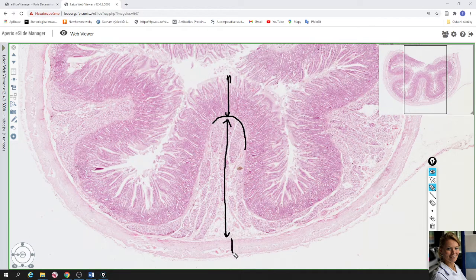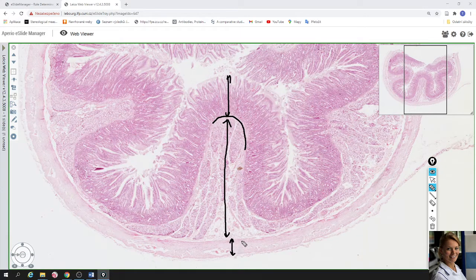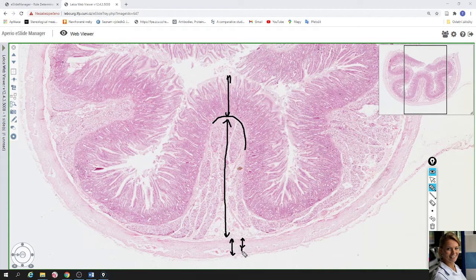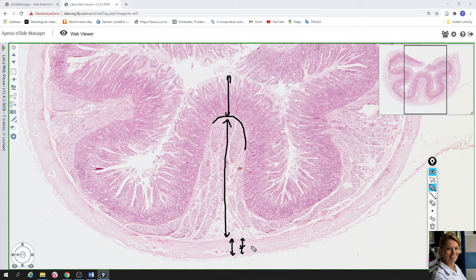The next layer is called tunica muscularis externa, which is formed by two layers of smooth muscle cells. The first direction is circular and the second direction is longitudinal. Between the two layers of smooth muscle cells you can find the plexus myentericus Auerbachii.